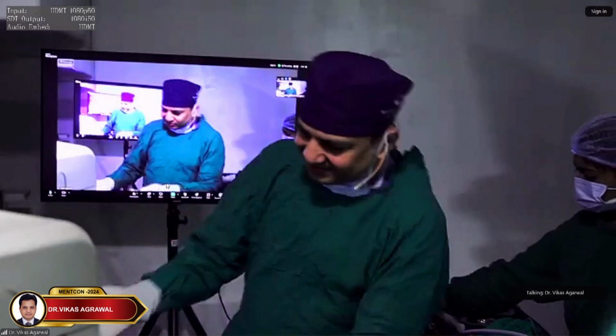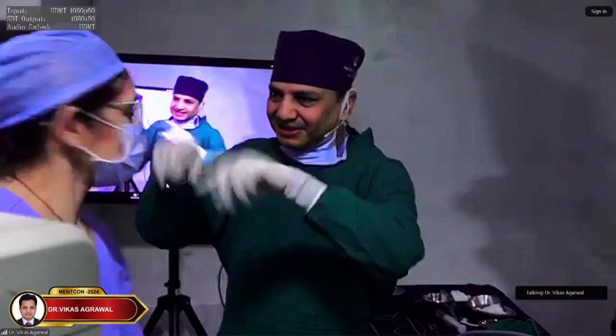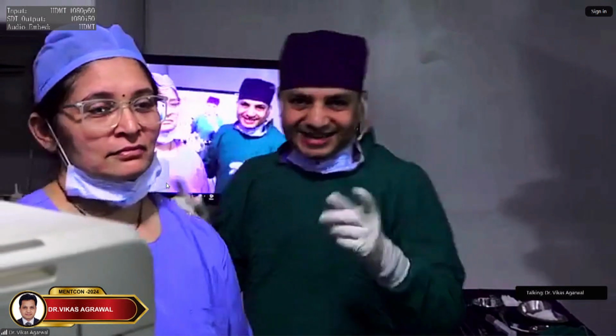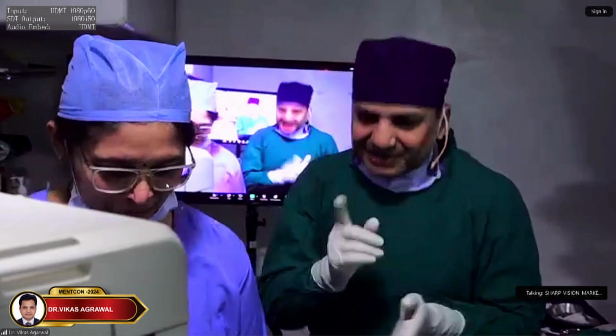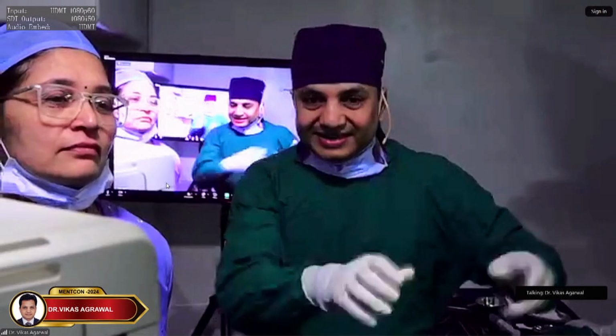Dr. Vanita, can you step here in front of the camera? This is Dr. Vanita, mask down please. This is Dr. Vanita, wife of Amit Seth, our ENT colleague. She cursed me like anything. Arey, kya kar raha hai? Why are you wasting so much time? I think that's the story with everybody who started doing coblation. Absolutely. So she also said, leave it, do it your regular way. Forget about coblation on adenoid tonsil. Do it your regular way.